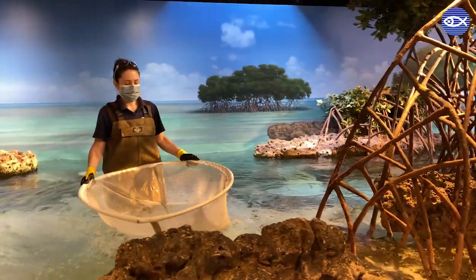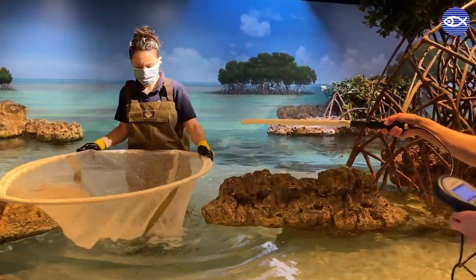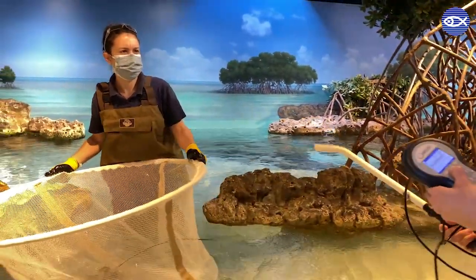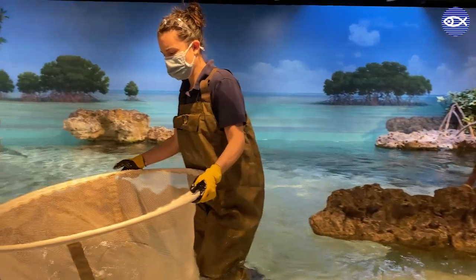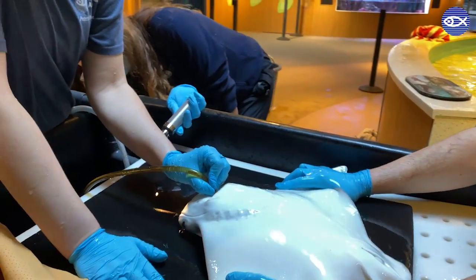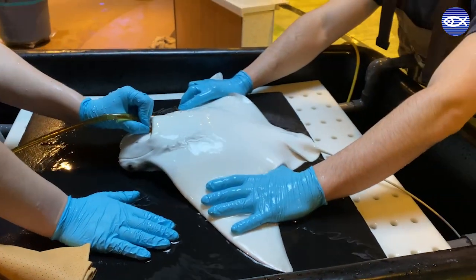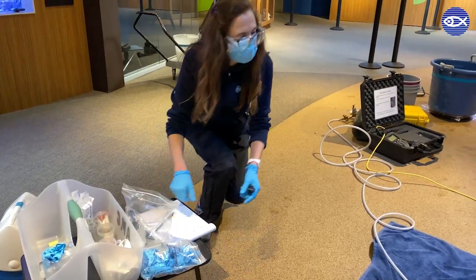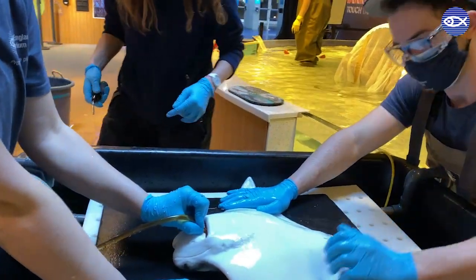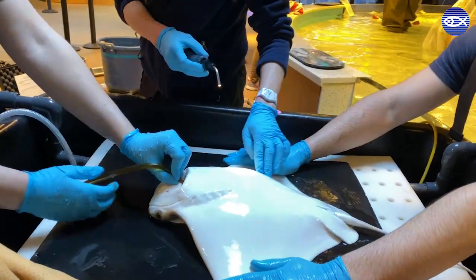A second cow nose ray has been caught, scanned for her PIT tag number, and we've confirmed that she too is due for an exam. She is placed in tonic immobility, just like the first ray, and then her breathing tube is placed in her mouth. In addition to the blood collection, all of the rays receive a complete physical exam, including an eye exam, skin exam, and a check for any lumps or bumps for a complete assessment of their overall health.